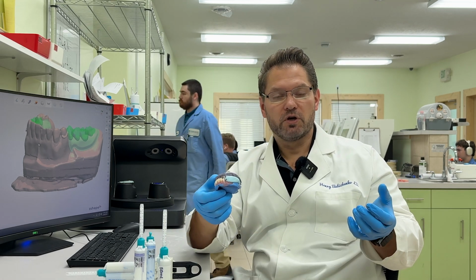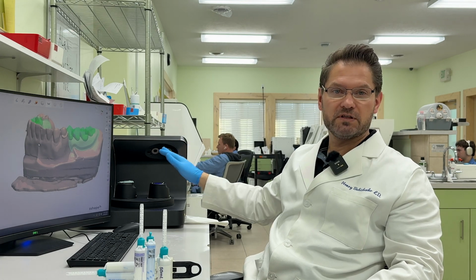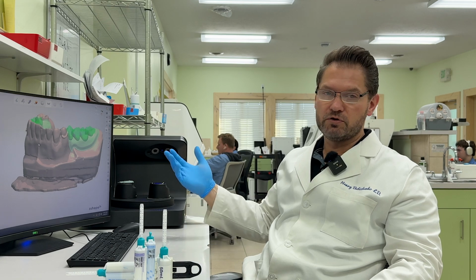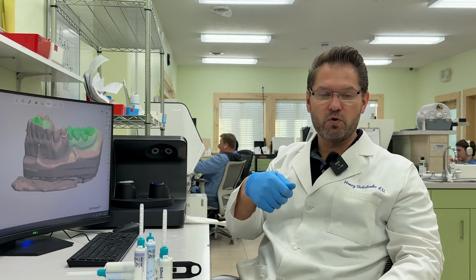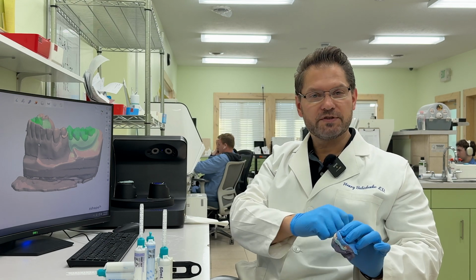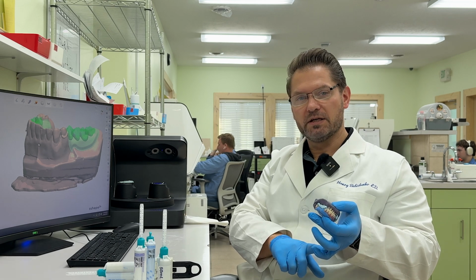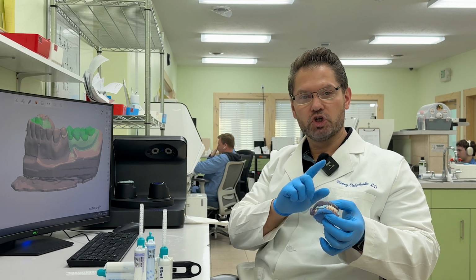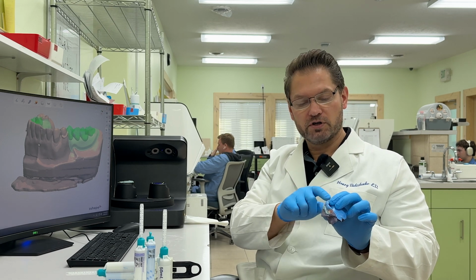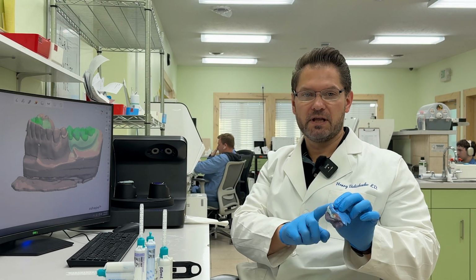So next step, we're just going to go ahead and scan. Right here, I have a desktop scanner. If you have a desktop scanner in your office, you can use that. It's nice and easy, but if you don't, you can actually use your oral scanner. Just go ahead and scan the tissue side of it and the outside of the denture. Therefore, from one appointment, you will have a good functional impression. You will have the patient's vertical dimension, centric relationship, the position of the teeth, and the midline.